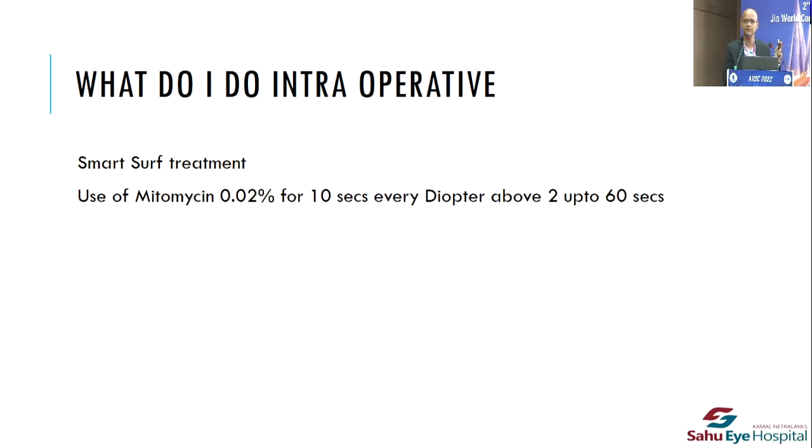Intraoperatively, smart surface treatment, I think, is revolutionary, and that's the greatest technology advancement that has occurred. Using mitomycin C with a 0.02% concentration, and I do it for every diopter, we do it for 10 seconds up to 60 seconds.